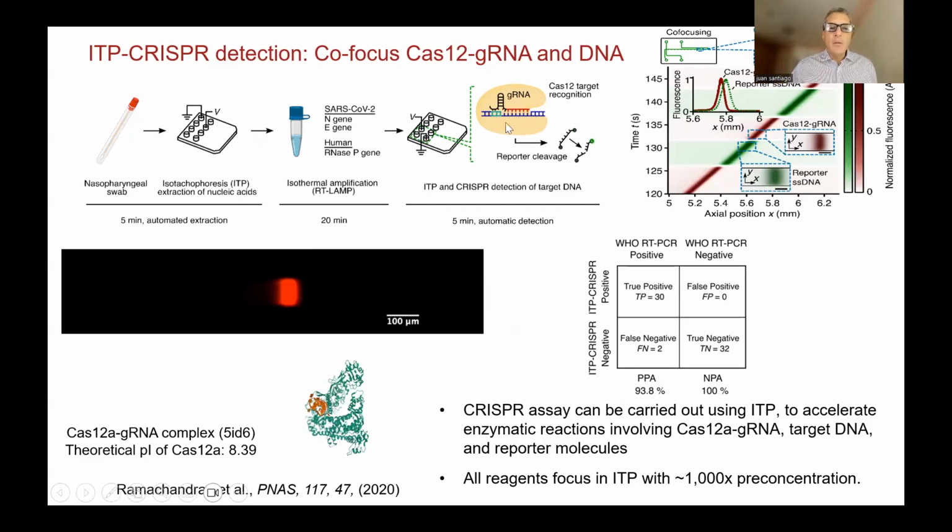In the end, based on these very high rates that were published for CRISPR kinetics, we first thought we could do this without pre-amplification. We tried it for several months, during the initial part of the lockdowns of 2020. Eventually, we convinced ourselves that we needed pre-amplification, despite our back-of-the-envelope estimates of the possible sensitivity using this electric field enhancement. So we basically used this electric field to purify nucleic acid.